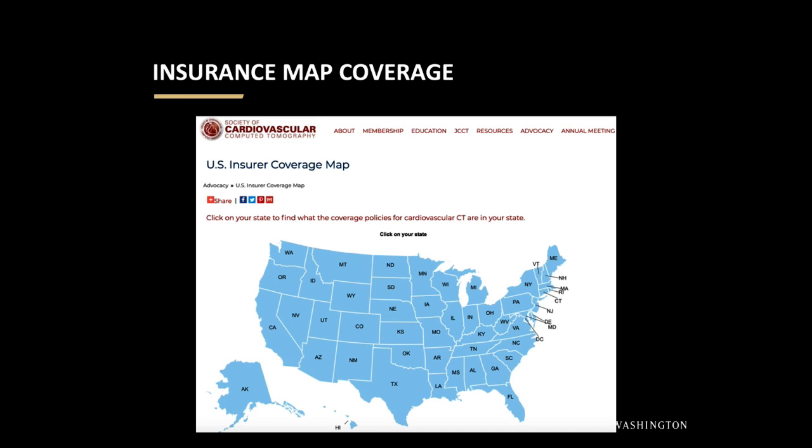That really was a good talk. And getting back to the issue of the calcium in particular, apparently there's a new analysis of the PROMISE data suggesting that in older patients, CT doesn't do so well compared to functional stress testing, mostly nuclear from what I understand. But in younger patients, it is actually better, presumably because there's just not as much calcium to obscure the scan. So do you think that we should decide on our testing based on age?